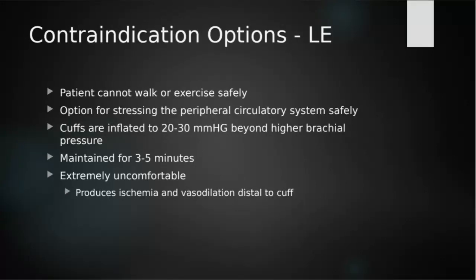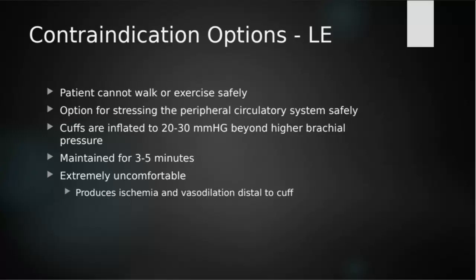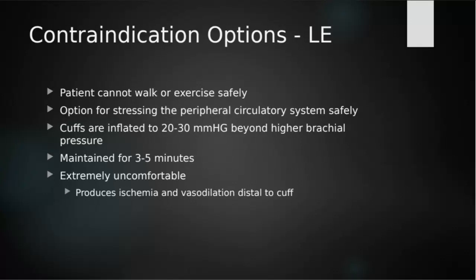We're not even doing exercise segmental pressures that often because it's like, all right, well, you either have arterial disease or you don't. And there are other ways for us to find that out rather than taking pressures every 2 minutes after you exercise or doing this sort of barbaric mimic of exercise on the system by cutting off blood supply to your feet. It's a little bit unnecessary when we can just do other types of diagnostic imaging to get the answers that we need.